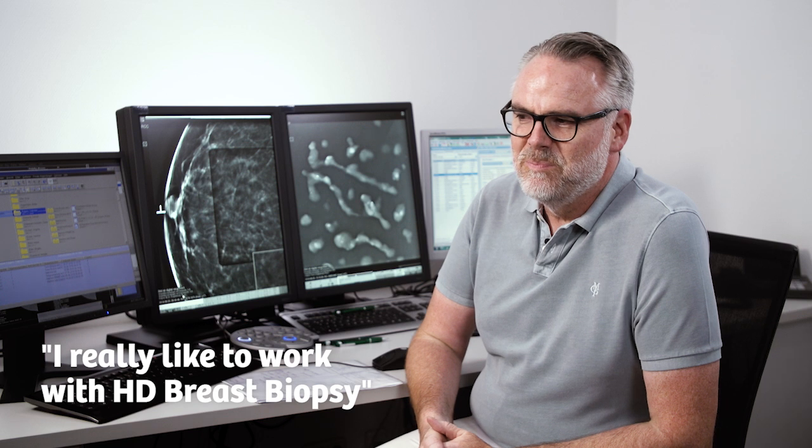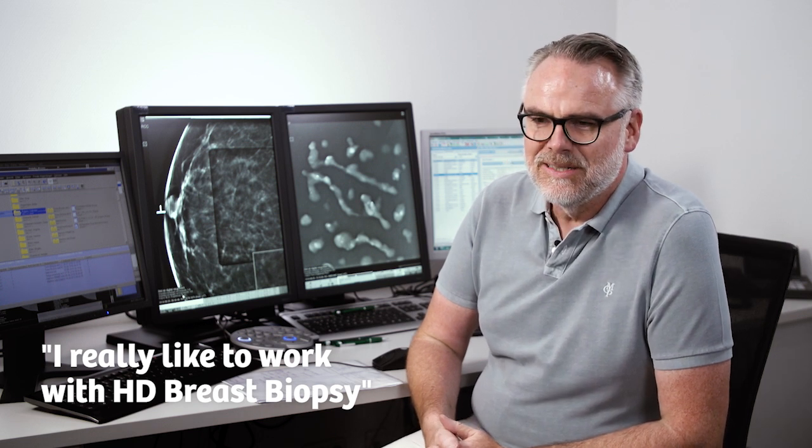I have come to really enjoy working with tomobiopsy, and I speak as someone with many years of experience using the prone table. That's why I found it a little difficult in the beginning to make the change to working with a new method.